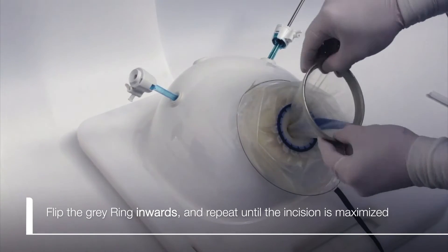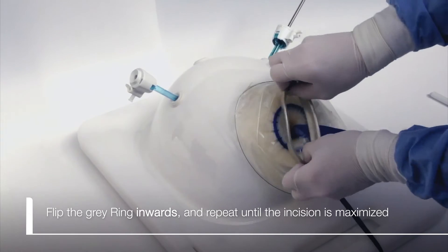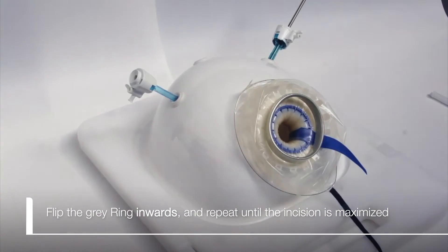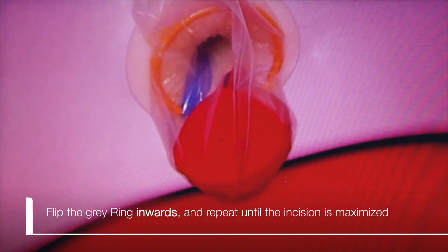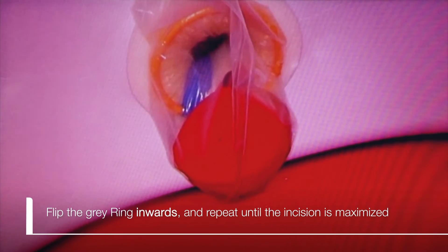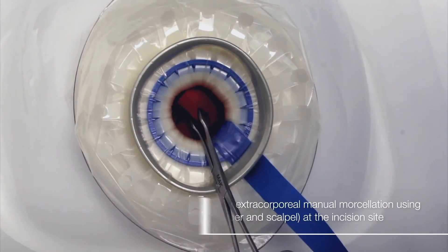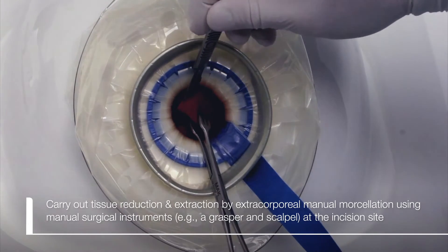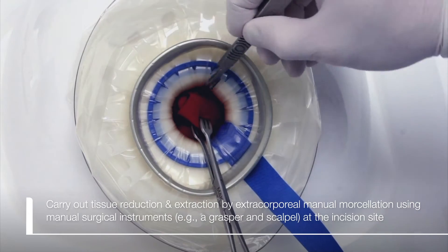Flip the gray ring inwards and repeat until the incision is maximized. Carry out tissue reduction and extraction by extracorporeal manual morcellation using manual surgical instruments, for example a grasper and scalpel, at the incision site.